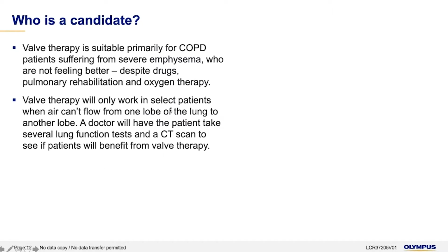So what we do to figure this out is just two tests. One is full pulmonary function tests, which I'm sure everybody has had. It's not just the simple spirometry. It is a measurement of your lung volumes. We need to know how big your lungs are. And equally important, if not more important, is the CAT scan, a CT scan without an infusion, simply to quantify the emphysema, to look to see if you have an area with more disease and another area with less disease, and that what's called the fissure, the barrier between the lobes of your lung, is intact or not. Conceptually, if we are going to be trying to shut the front door to a region of your lung, and we're going to let all the air out, you can't have a back door refilling you as I empty you.